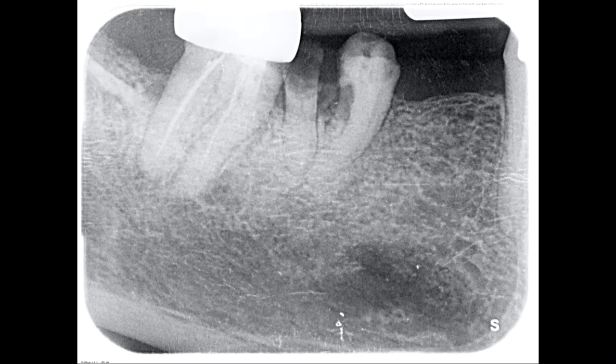In this video I will show you how to treat peri-implant bone deficiencies. It is a clinical situation that very often happens in everyday practice. I did my regeneration using guided bone regeneration by means of a collagen resorbable membrane.